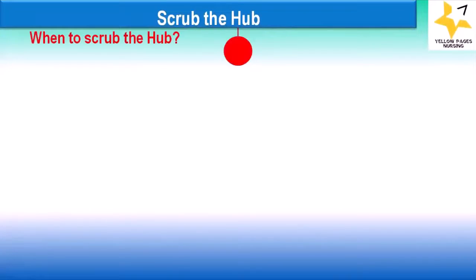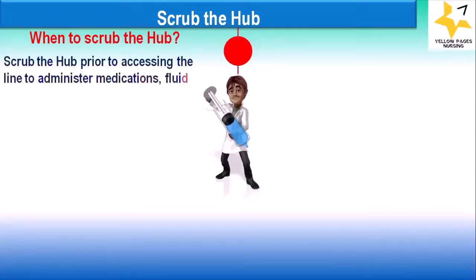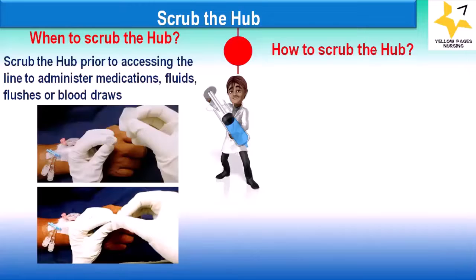When to scrub the hub? Scrub the hub prior to accessing the line to administer medications, fluids, flushes, or blood draws. And how do we scrub the hub?